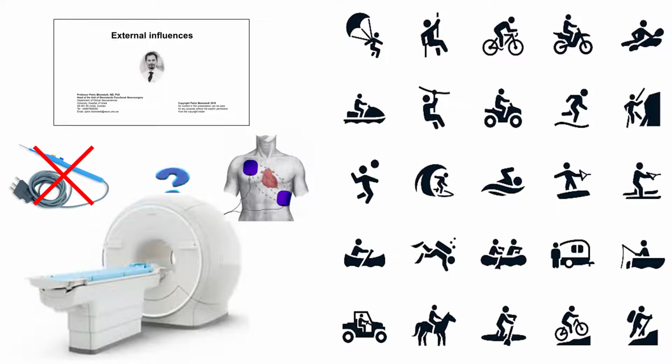DBS is done in order to improve the quality of life of the patient, and after surgery the idea is that they should be able to forget that they have undergone this procedure. The implants will not break or change position if they fall or suffer minor trauma, and they can virtually do whatever they want without taking the DBS into consideration.